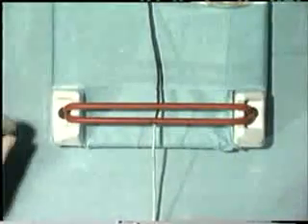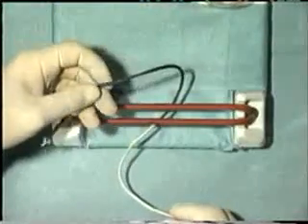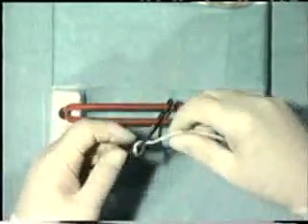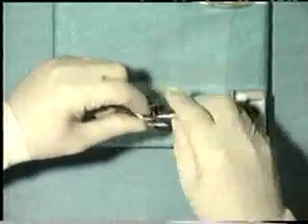Using the jig provided, practice tying a standard two-handed reef knot as seen here. At the end of the procedure, you can see the classic picture of a reef knot, as clearly shown by the different colour threads.